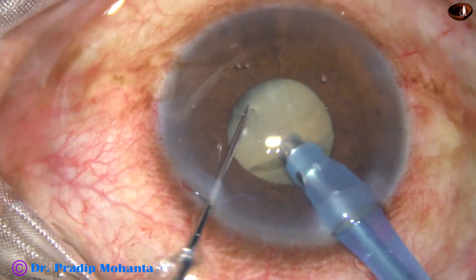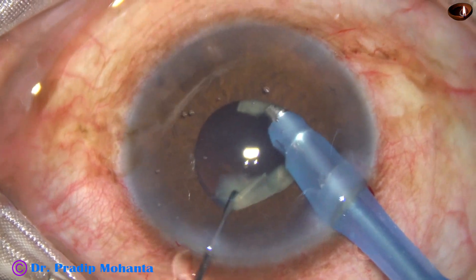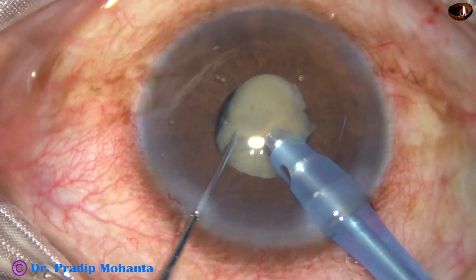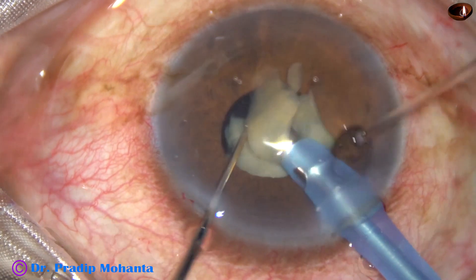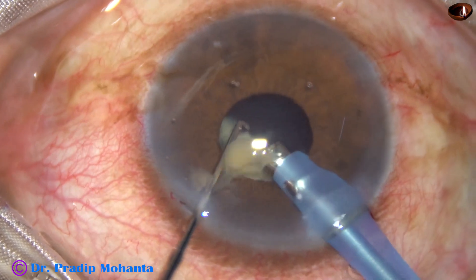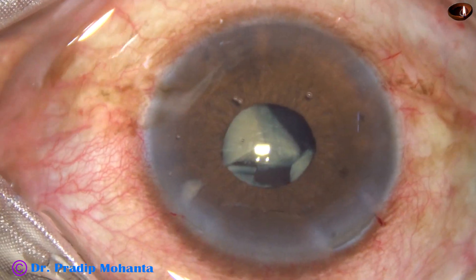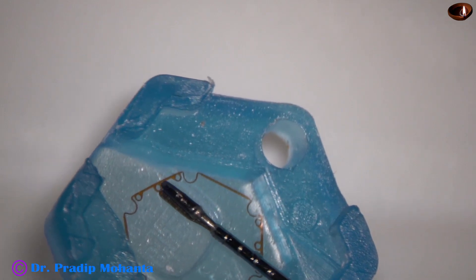This is a free-floating nucleus. There is no epinuclear cushion around. So the chance of catching the posterior capsule is much more in such cases than in immature cataract — there is no epinuclear cushion protecting the posterior capsule. At this moment, the size of the pupil has become very small, about 2.5 mm, and I thought of using a pupil expansion device.